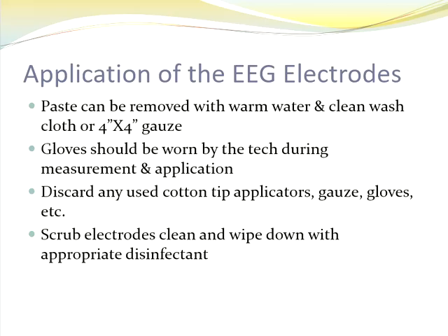You're gonna want to wear gloves while you're measuring and applying the electrodes, especially on the scalp. You just don't know what you're gonna find in the scalp and in the hair until you get in there. Anything unused needs to get thrown away. Anything you bring into the patient's room is that patient specific. So you want to try to be careful with how much of your materials that you're utilizing. You don't want to have too much extra because then at the end you might have a lot of waste. So being a little precise with knowing exactly what you need so you don't have a ton of waste at the end of your application.